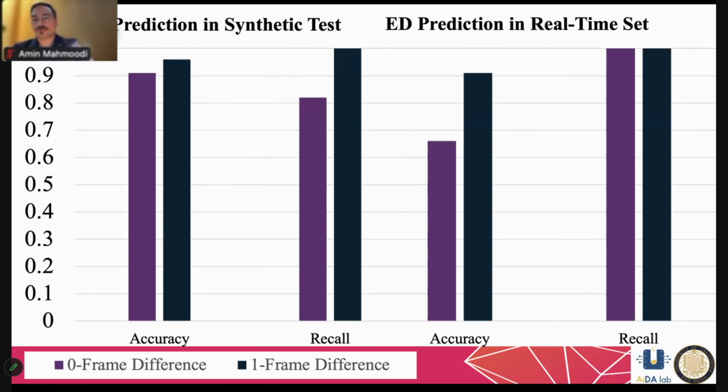However, we do get a decrease in the accuracy. We are getting some false positives predicted by the model. It's predicting too many, for example, end-diastoles. And this problem mitigates a lot once we allow 1 frame leniency, so instead of the exact end-diastole, 1 frame to the left or right of it. Here's what that would look like.